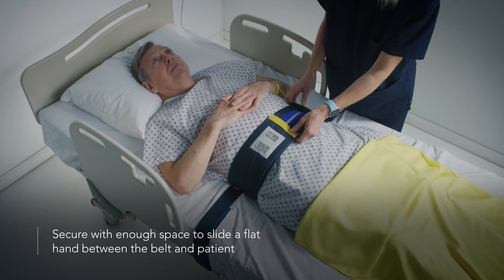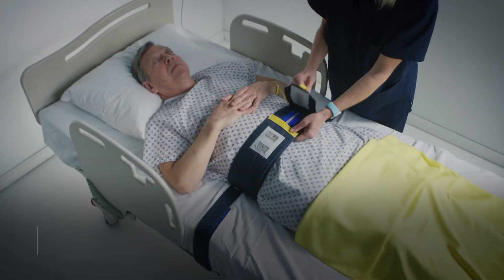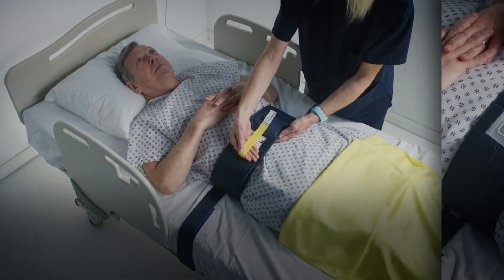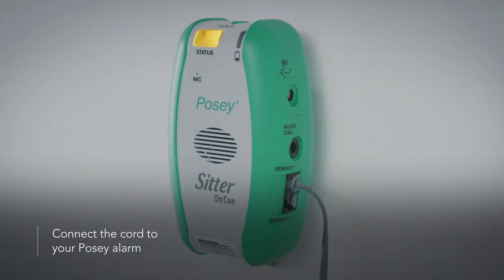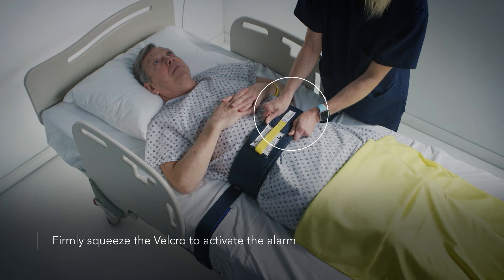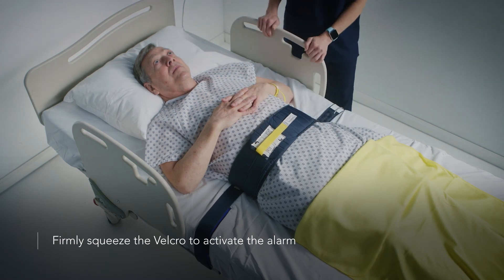Secure with enough space to slide a flat hand between the belt and the patient. Slide the adjustable handle to connect the white velcro pieces, ensuring they are aligned and secured for proper operation. Tuck or cover the inner yellow handle to ensure sensor alignment. Connect the cord to your POSI alarm. Use your fingers and thumbs on both hands to squeeze the velcro firmly on the underside and top of the belt to activate the alarm, ensure proper device function, and help prevent false alarms.